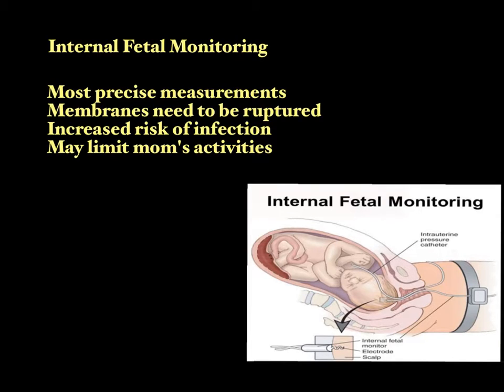You work in a different hospital, you might have different policies and procedures that guide you, but even with internal monitoring, if you want that woman to really be active and walk around, you have to take great care not to let any of this stuff get dislodged. So that is internal fetal monitoring.